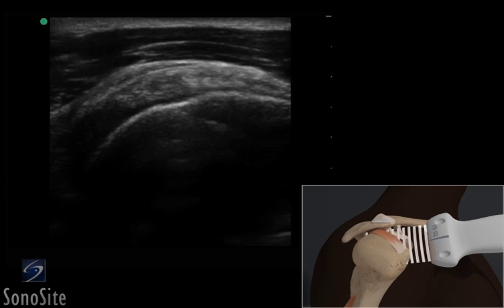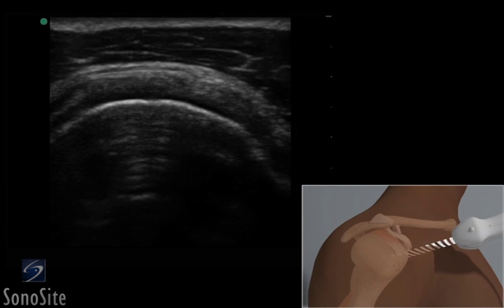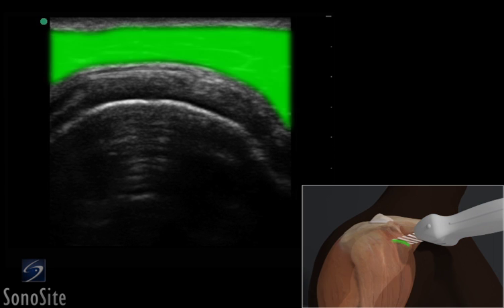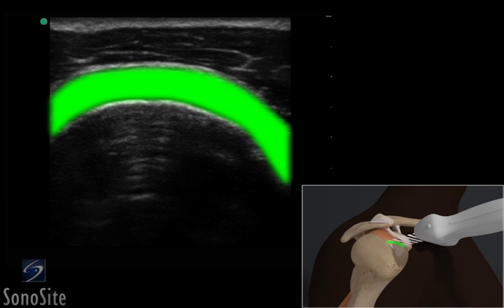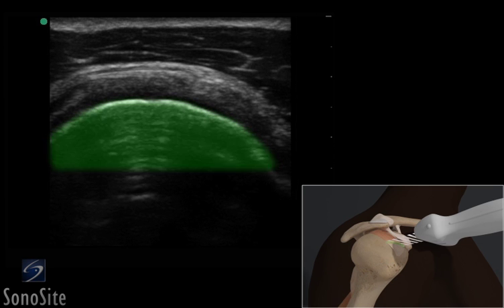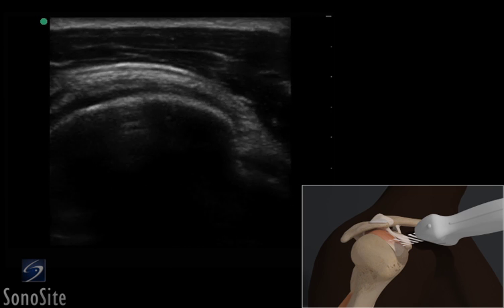The patient is then asked to direct their hand toward their opposite back pocket palm out to complete the evaluation of the supraspinatus tendon. The deltoid muscle is the most superficial structure. The subacromial subdeltoid bursa is seen as a thin, dark, hypoechoic line between the deltoid muscle and the supraspinatus tendon, with the bright hyperechoic humeral head deep to the tendon. The transducer is slowly moved from side to side to evaluate the integrity of the fibers.